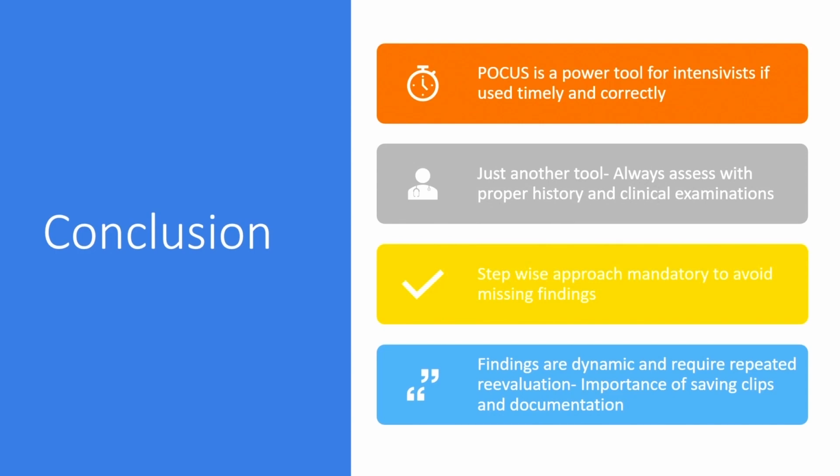Findings are dynamic and need repeated re-evaluation. Importance of saving clips for documentation, because things change over time. You may not be there at the bedside all the time. Some of your colleagues may be there. If you have a clip, it says, "Earlier the heart function was like this, a little later it has become like this." So you have an idea what is there, what is new, what has developed, and you can guide your therapy accordingly. Thank you.